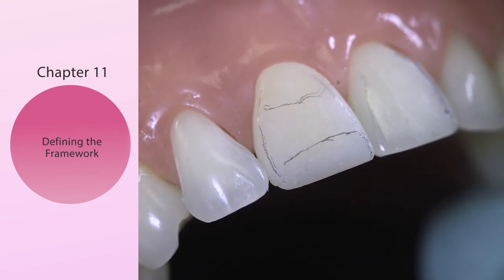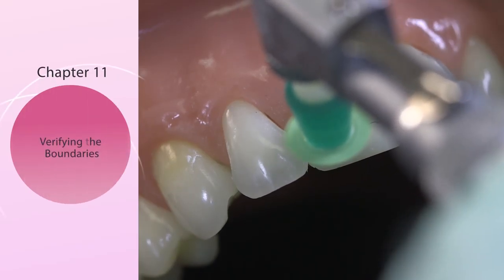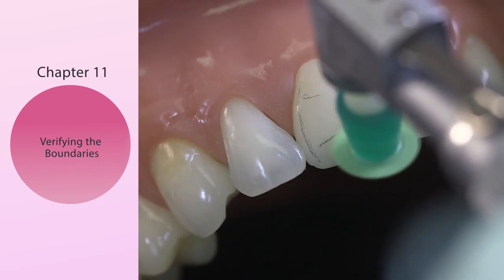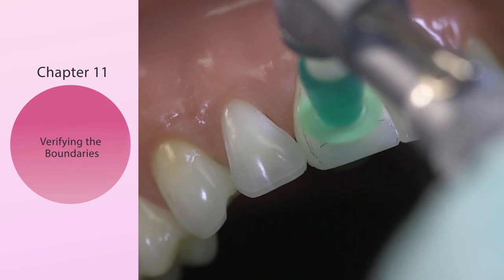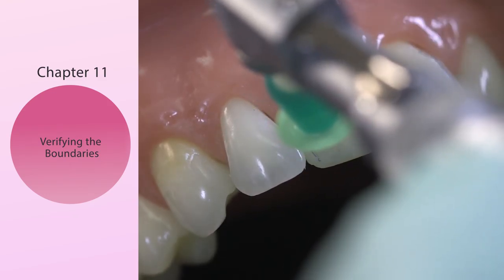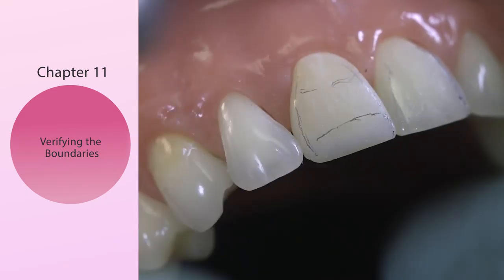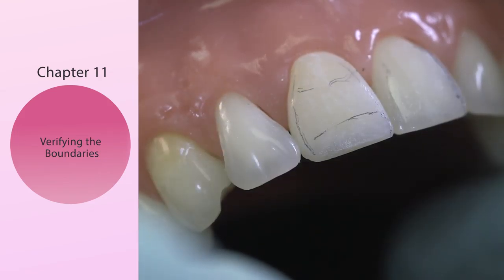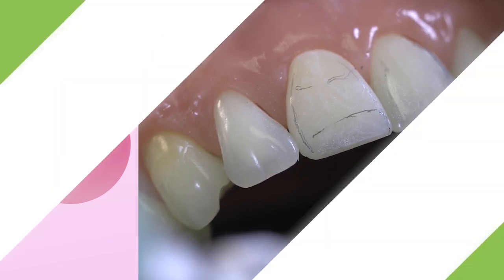What I'll demonstrate now is to individualize these line angles. All this geometric shape has to mirror the adjacent tooth before we go into the polishing sequence. I'm going to verify the face of the tooth very lightly, staying away from my lines. If I wanted to go up here on the cervical, I could verify that. And if I wanted to go into the incisal and verify that I've bent that tooth in three different dimensions — zone one, two, and three — I can do that.